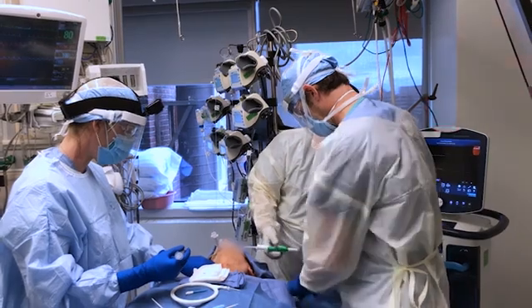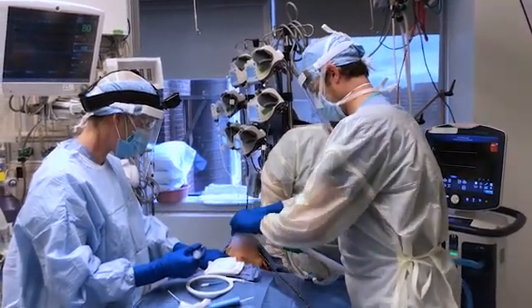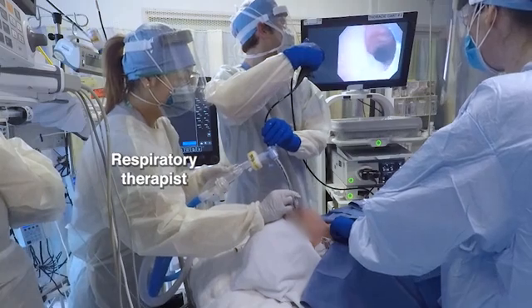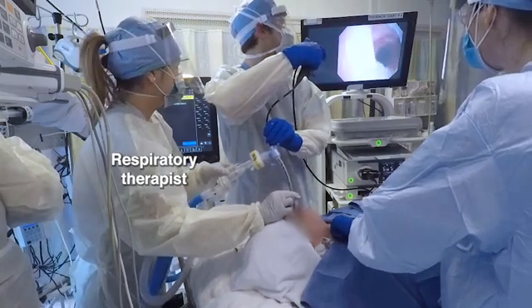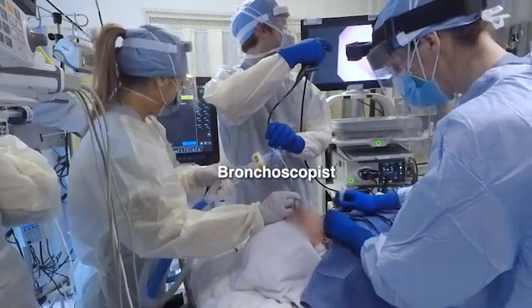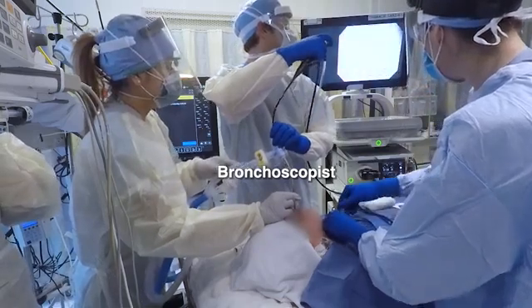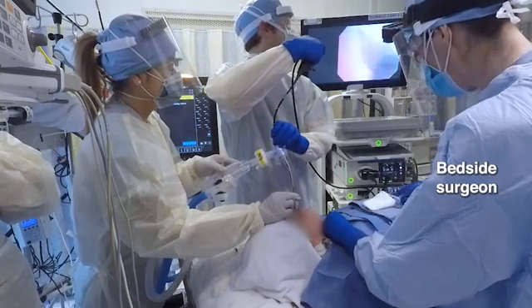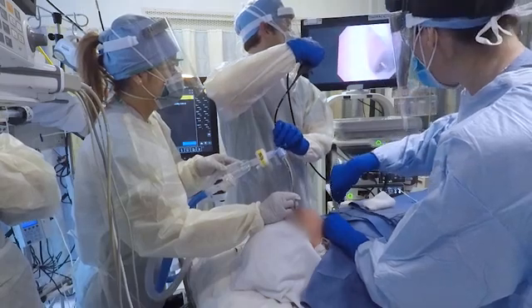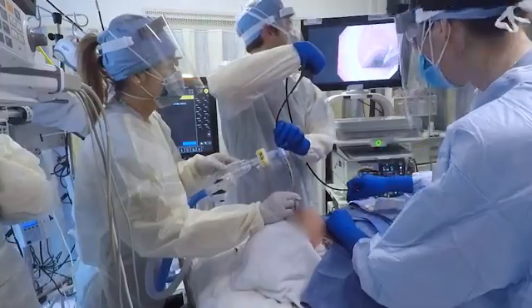Make sure that each team member is positioned to carry out the necessary procedures safely, effectively, and efficiently. The respiratory therapist should stand at the head of the patient's bed, where the therapist will have direct control of the airway and access to operating the ventilator. Position the bronchoscopist at the patient's left side, next to the bronchoscopy cart and video monitor. The surgeon should be on the patient's right side with direct view of the bronchoscopy monitor; however, a left-handed surgeon may prefer to be on the patient's left, with the bronchoscopist on the patient's right.